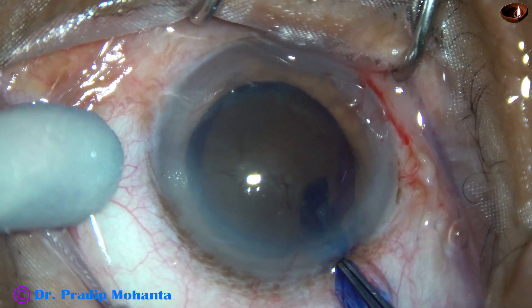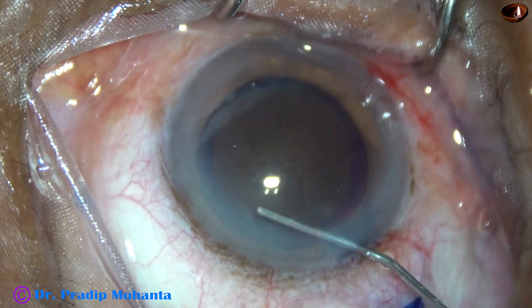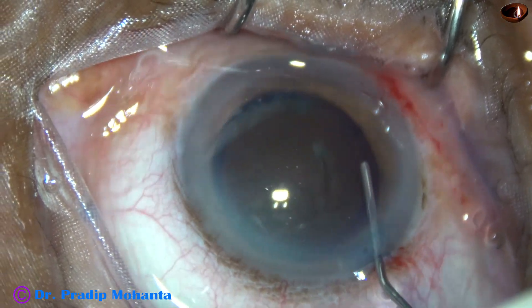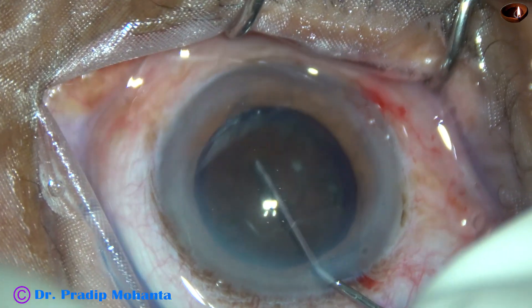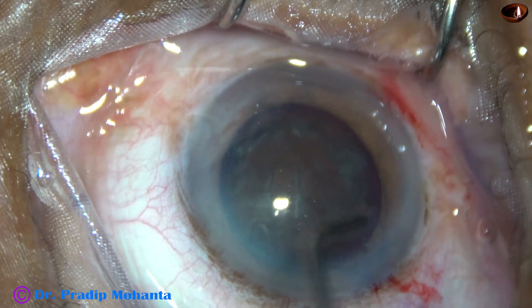Now hydrodissection is to be done. A 27-gauge cannula and BSS is used to perform the hydrodissection. The nucleus is mobilized and rotates very nicely.